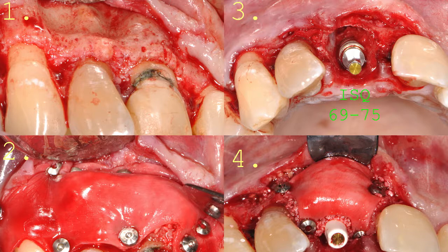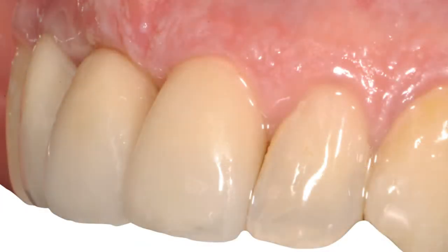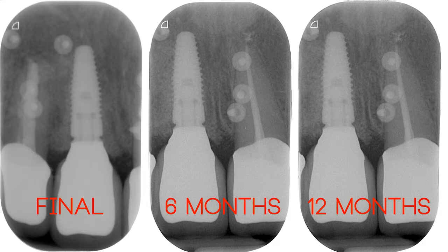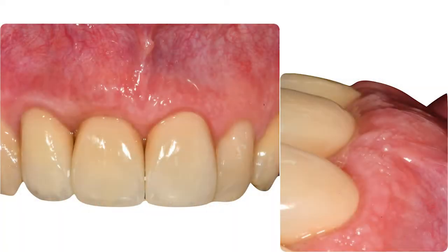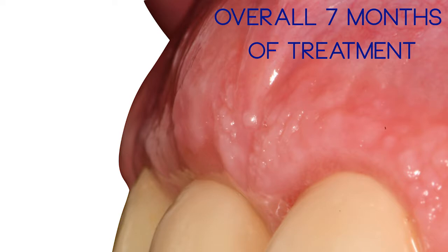Another GBR procedure with a minimally invasive approach, immediate provisional, and immediate loading of this case. And this is the final result. Here we can see a close-up of the bone surrounding the neck of the implant, which is stable. Actually, we have a follow-up of up to 1.5 years for these cases. And this is the final appearance of the soft tissue. So overall, it took us only 7 months to treat this case.